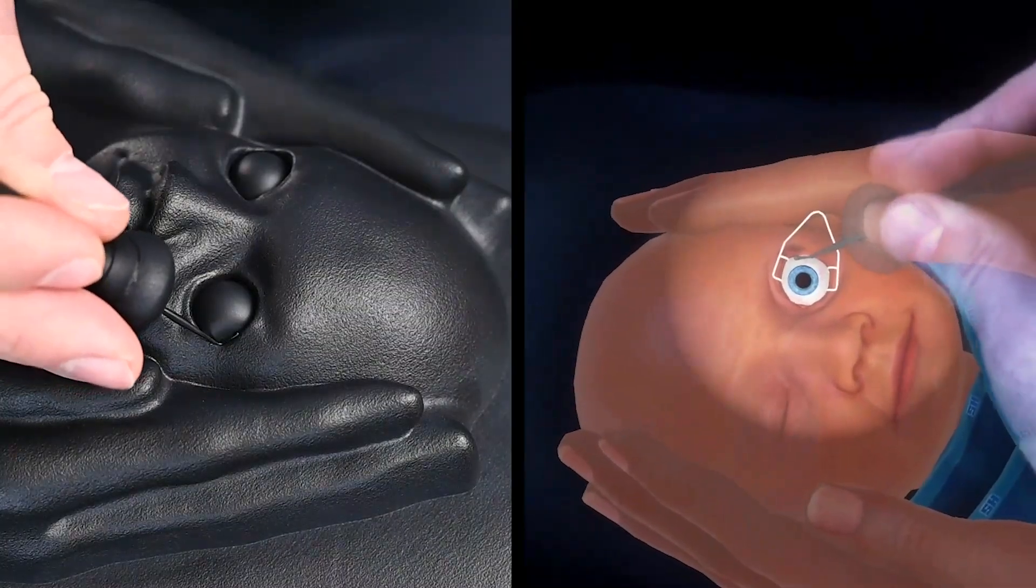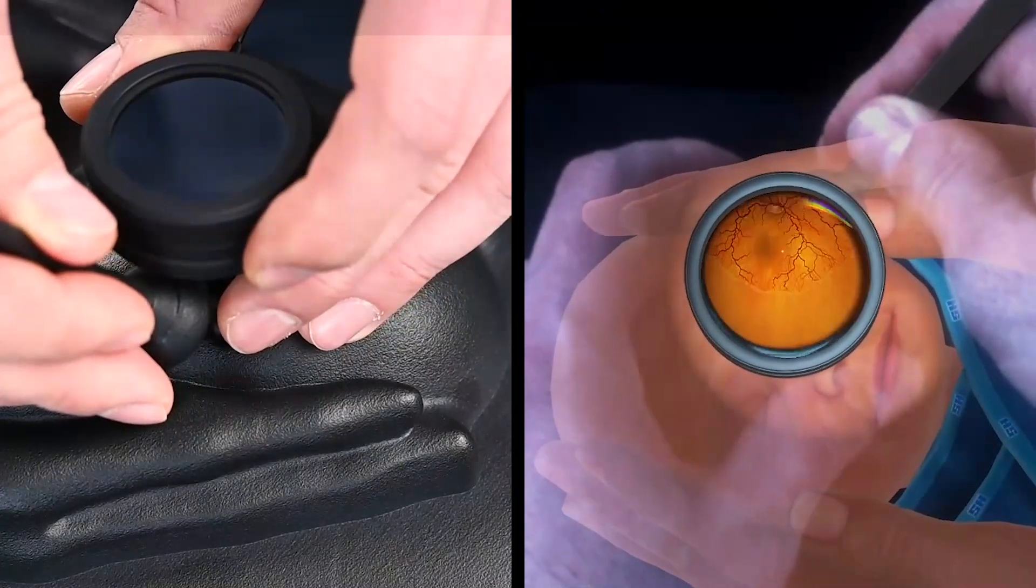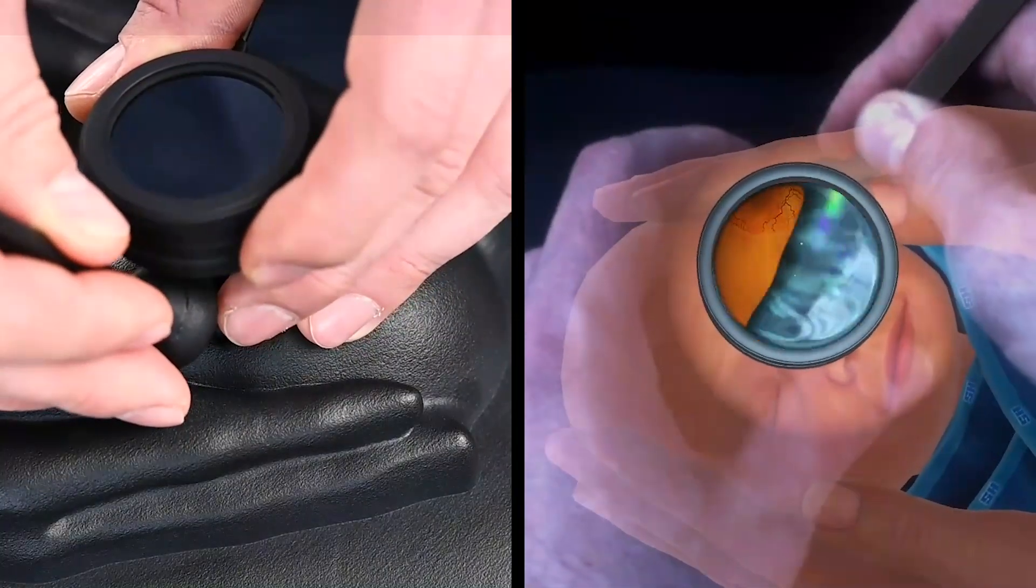To add to the immersive training environment, the pliable eyes can be indented and tilted into different directions using the scleral depressor.